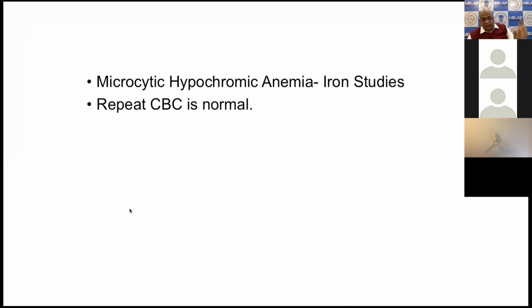In a 2 ml EDTA tube, they should collect the proper volume. It should not be overfilled or underfilled. Overfilled may cause some small clots, and underfilled may create this type of problem.